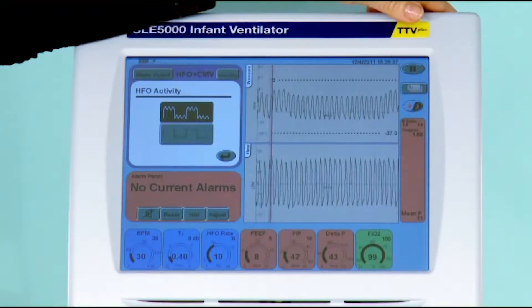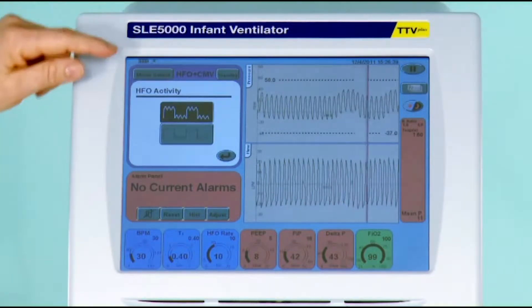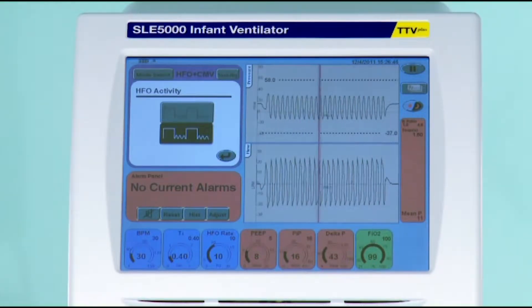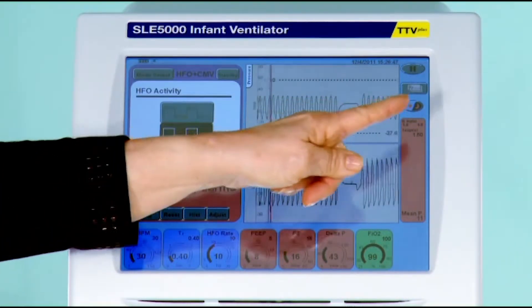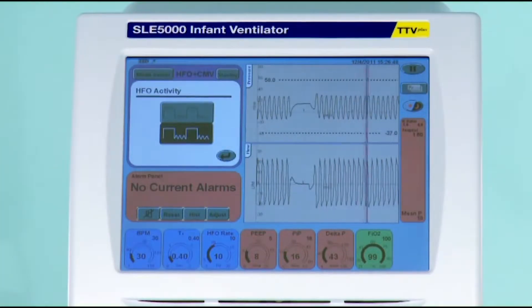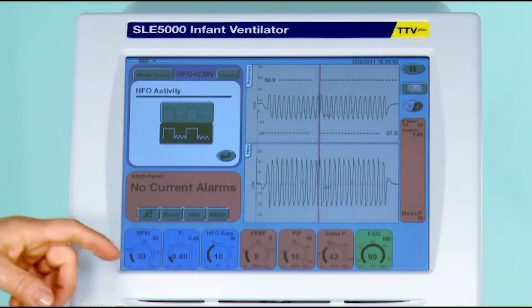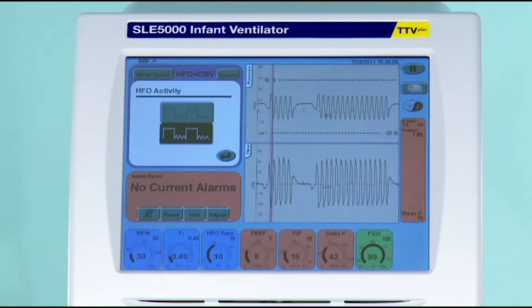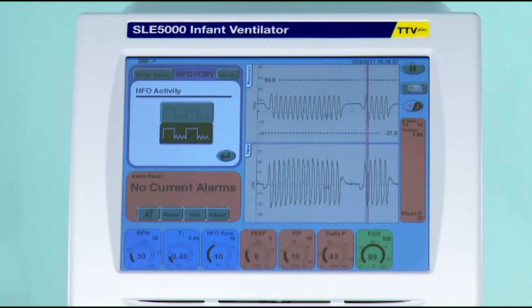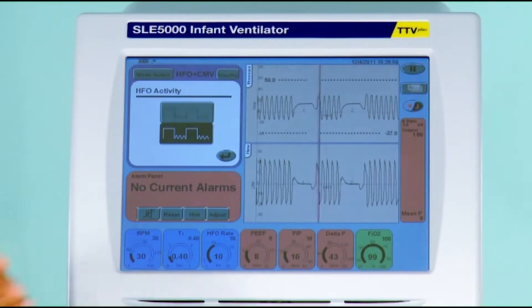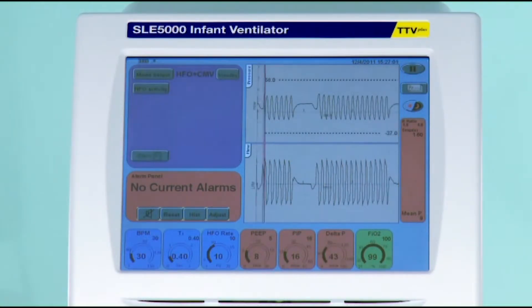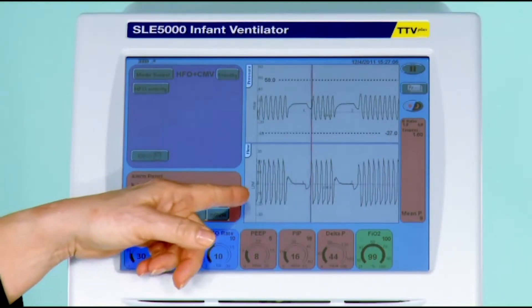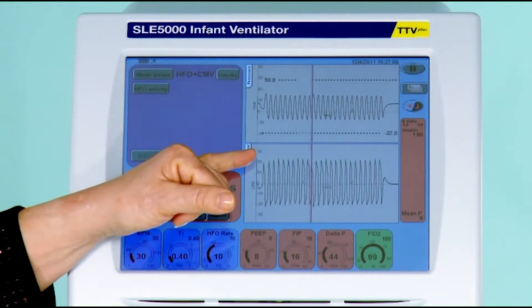Or you can select it to be on expiration only — that is inspiration, and that is the expiration. You might also notice that there are no measurements, because the flow sensor is not sure, out of all the parameters, what it is measuring. From the screen you can approximate your tidal volume, but more than that you cannot see.